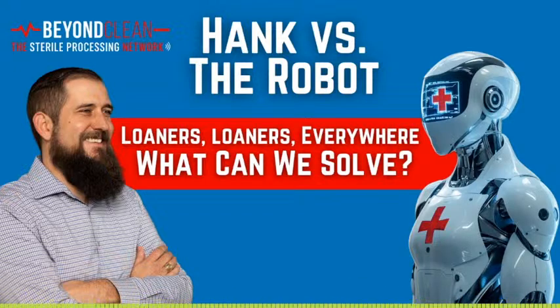Second, let's talk about outsourcing. This could involve bringing in external consultants or service providers who specialize in loaner tray management. These folks could work on site or even at centralized processing hubs where high volumes of loaners are cleaned and sterilized off-site. While outsourcing can have upfront costs, it might actually save money in the long run by improving efficiency and reducing surgical delays or instrument errors.